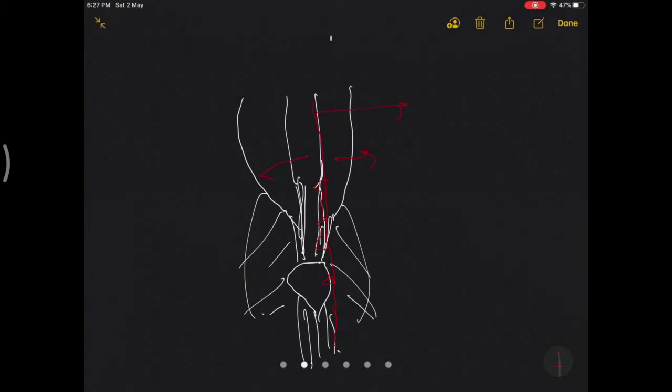So some people try to preserve as much quadriceps as possible, which is attached to the patella. Then came the concepts of mid-vastus and sub-vastus approach. In the mid-vastus approach, we take the approach the same below the patella and patellar tendon with a cuff of around 4 to 5 mm.